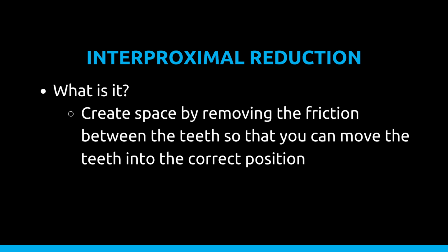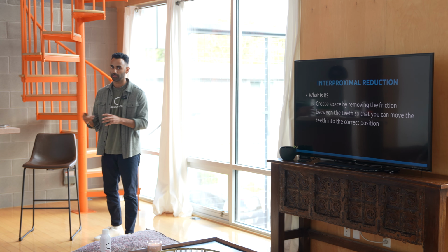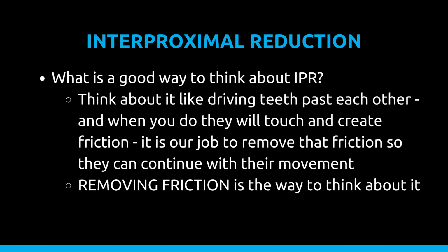And so a predictable and repeatable way to create space and resolve crowding is by IPR. So IPR, what is it? Basically, you're creating space by removing the friction between the teeth so that you can move the teeth into a correct position, right? So it's friction-based thinking to create space.